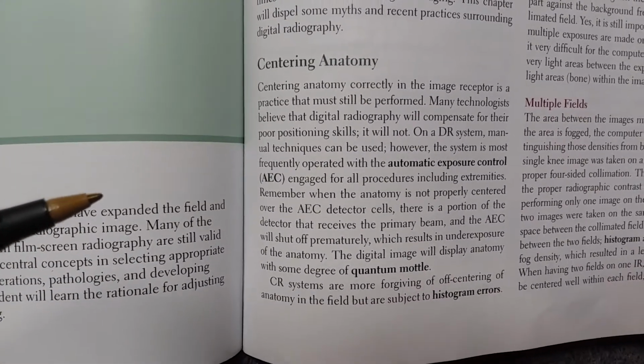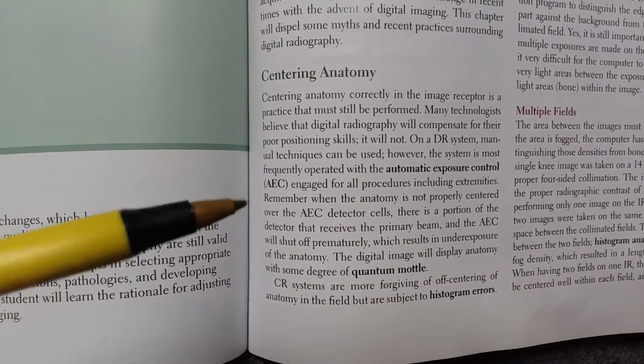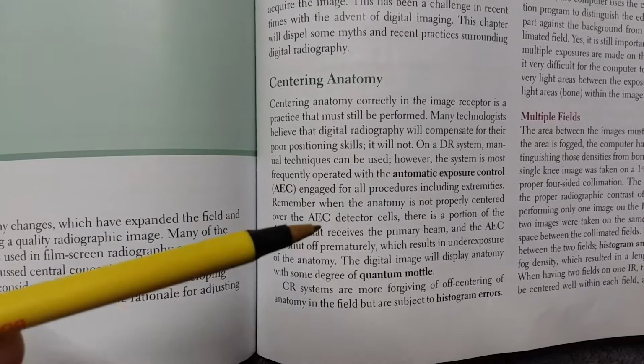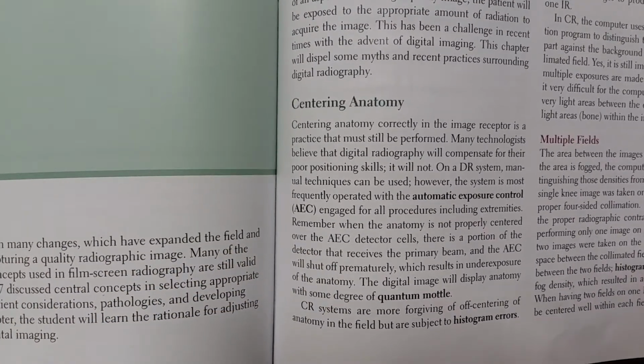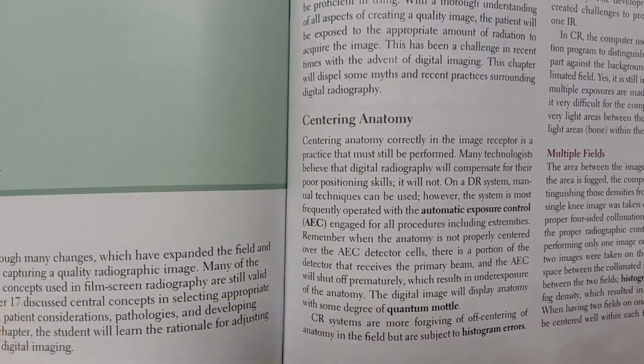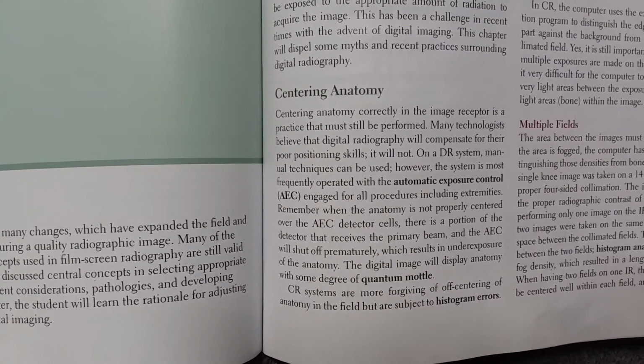Chapter 18 actually was on AEC, and it's very important to center the anatomy over the correct cell or you'll have premature shutoff, and that will result in an inadequate exposure and quantum mottle in the image, which is obviously not as good as the regular diagnostic image.